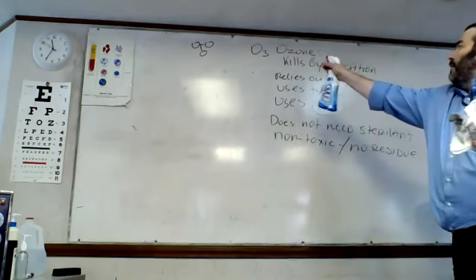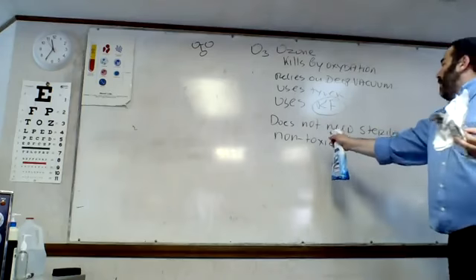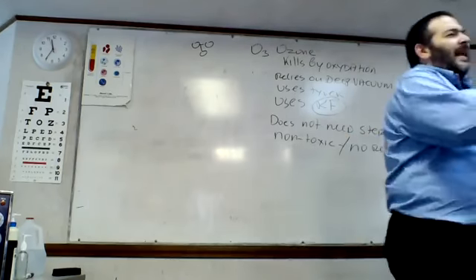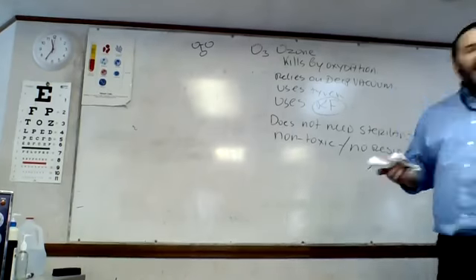But it says in the ozone, in the packaging, it says compatible with most products. It likes Tyvek. And on the test, that's what they're going to say. Tyvek. Right, Tyvek.